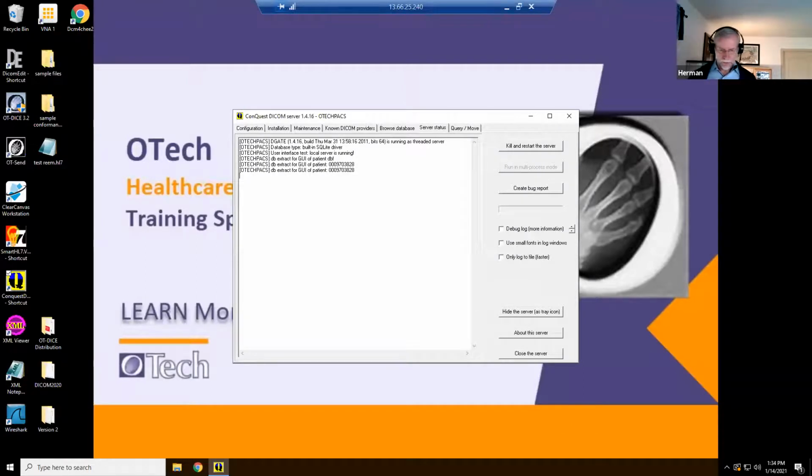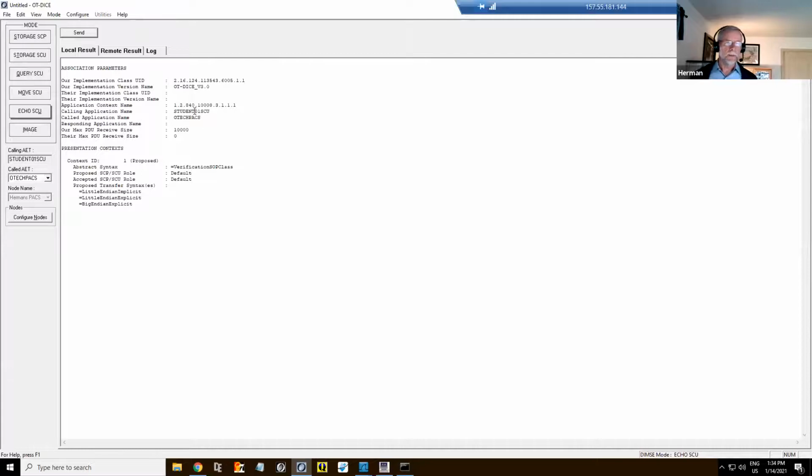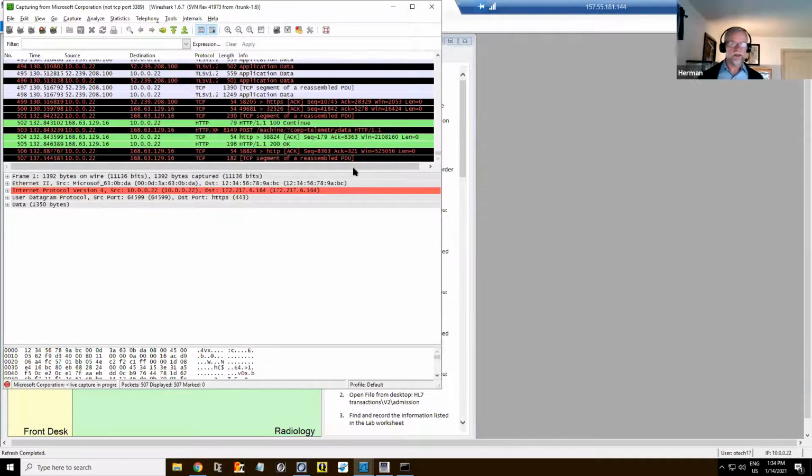Okay, so server status, I'm still there. And now I go back to my sending virtual machine. And basically I just do a send of my echo, right? So I have some local log files. I said, okay, I want to do the verification. I got a receive and I get my status success back, right? So now let's look at the sniffer. I send out the information and my sniffer is still going, but again, we have all this stuff going on.